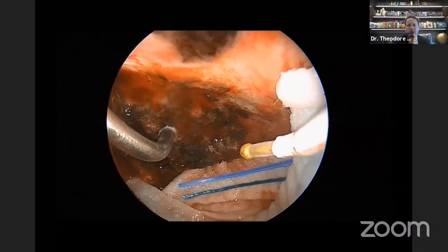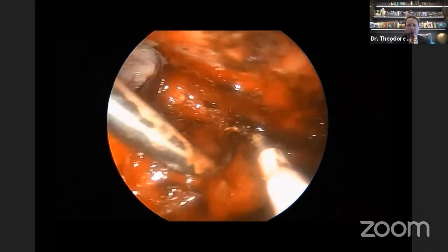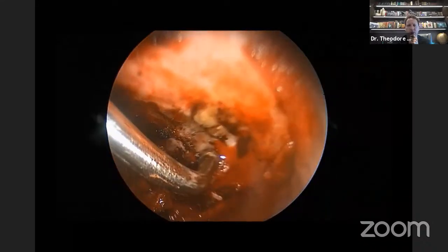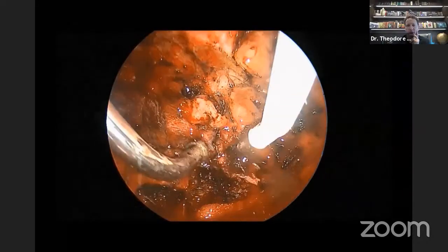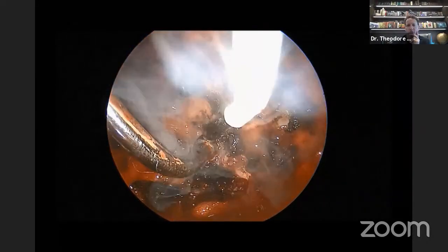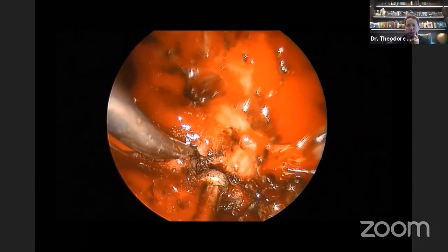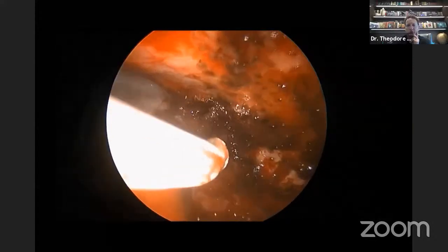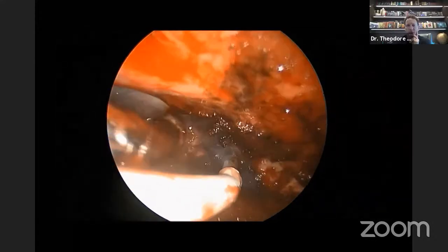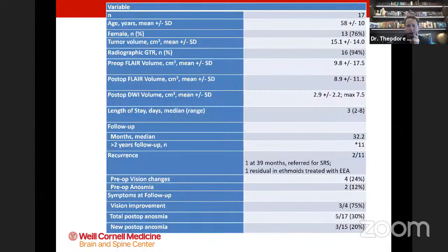Here's the endoscope. So you can see there's some tumor left in the cribriform plate anteriorly by the crista galli. But with a 45 degree scope, you can see that really well. And you can look around and do bimanual surgery, and you can buzz that dura down into bone. Now, you can't remove any hyperostotic bone with this approach because you really can't reconstruct the floor. So that's something you have to keep in mind, that there may be residual hyperostotic bone and tumor could regrow from there. There's the very anterior part of the tumor adjacent to the crista galli. So here's a post-op scan showing you the extent of resection.